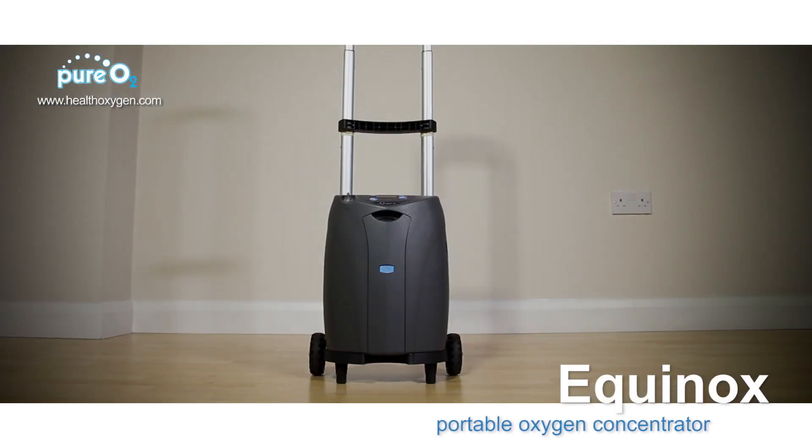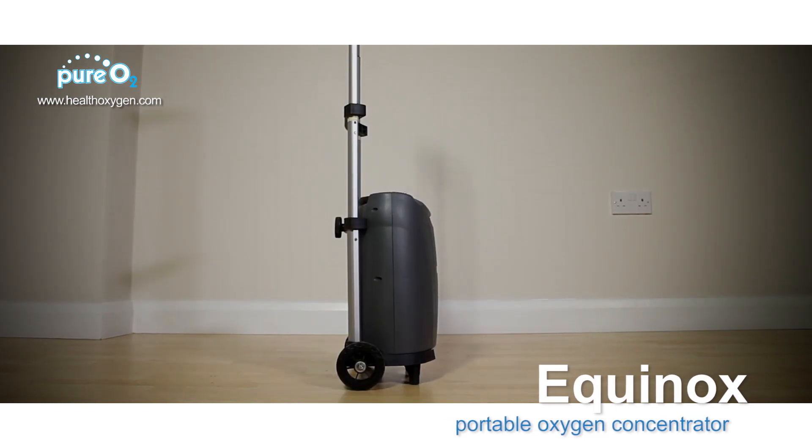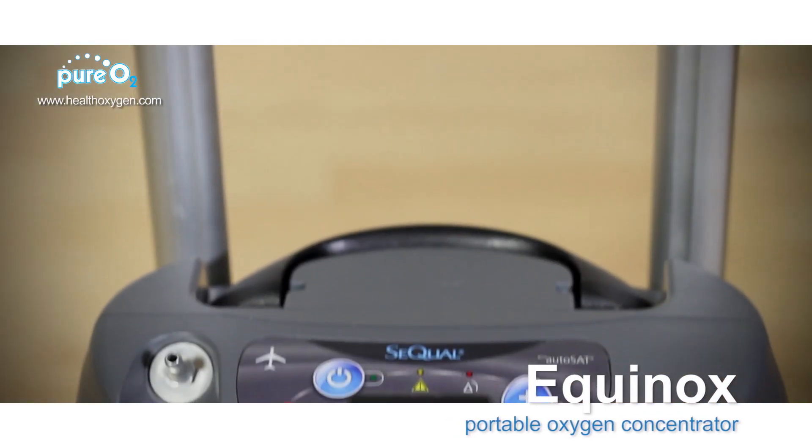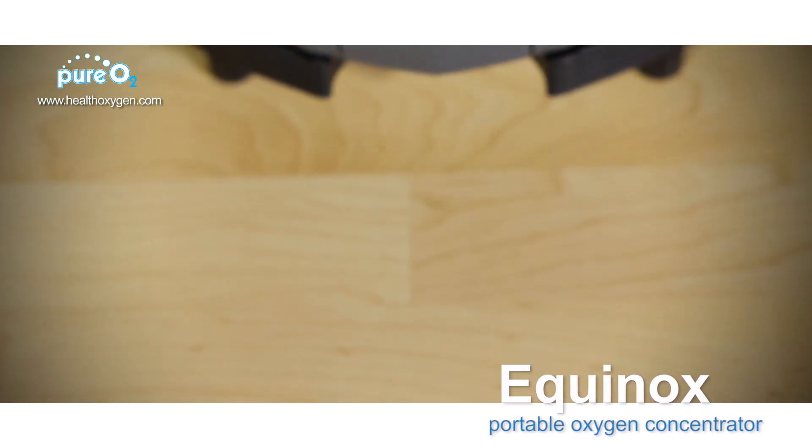The SeQual eQuinox transportable portable oxygen concentrator comes with highly flexible settings and is lightweight and compact, particularly relative to its capability and available settings.